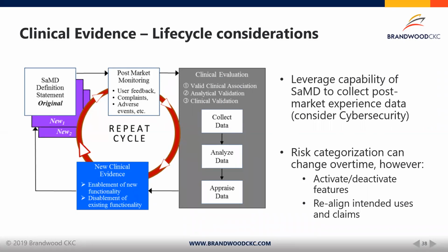And at the same time, one of the challenges is to keep the scope of the software in line with the state of approval by the regulator, or your clearance in the USA, for example, or in other jurisdictions, always true and in a validated state.